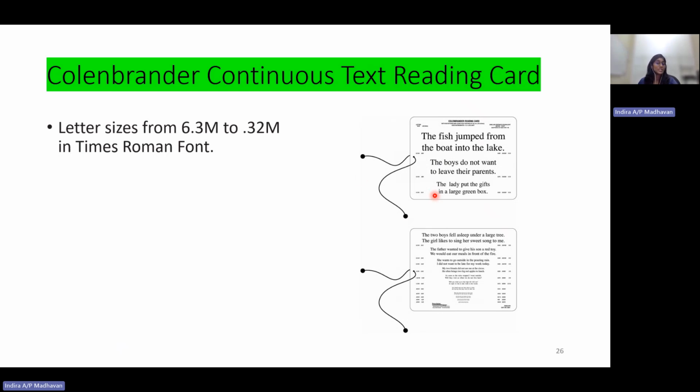when it comes to low vision assessment, we don't use this card. We use this card for normal people who read at 40 centimeters. While for patients who are low vision, we allow them to read at their habitual reading distance. We don't test their near VA at a standard reading distance. So this card is not used in the low vision clinic for near chart. Any near chart that comes with a card is not used. It is used for a standard one only.